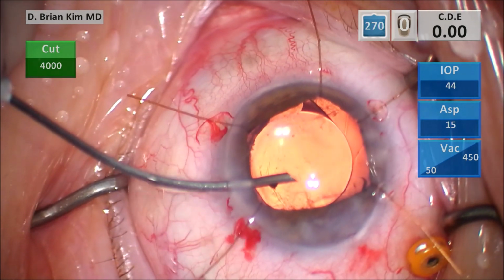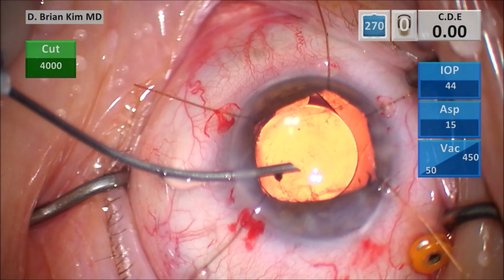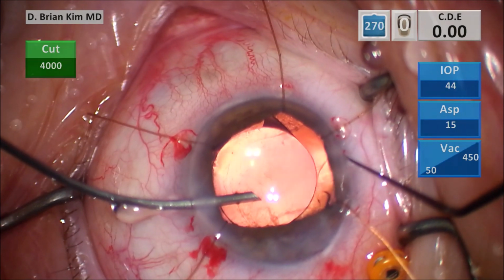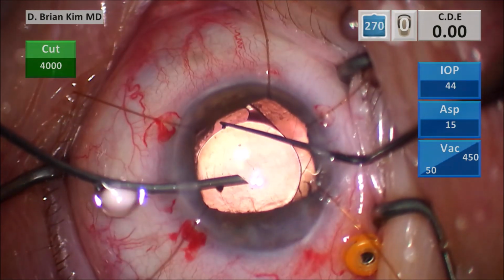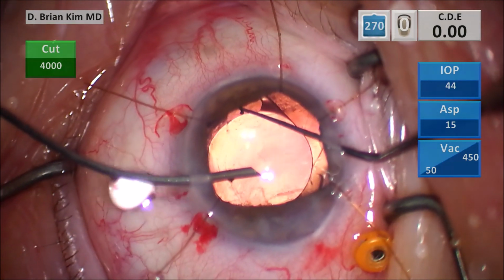And by doing it that way, it immediately alleviated the situation. The lens is better centered now. The lens is deep at the sub-iris plane, and everything's looking great so far. The haptics are oriented perfectly. Again, the anterior capsule tear is still localized. It didn't separate or spread any further. And again, this is how I decided to deal with this case.